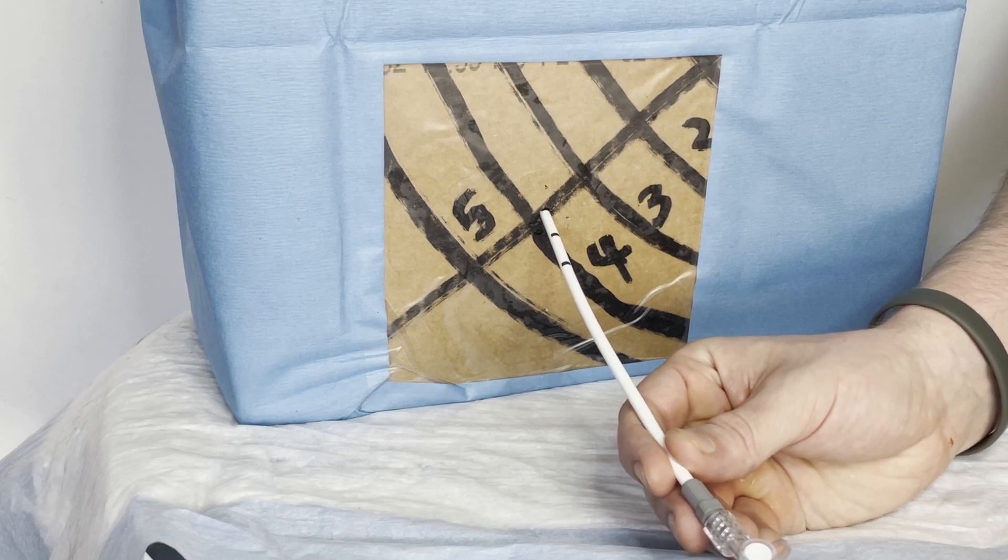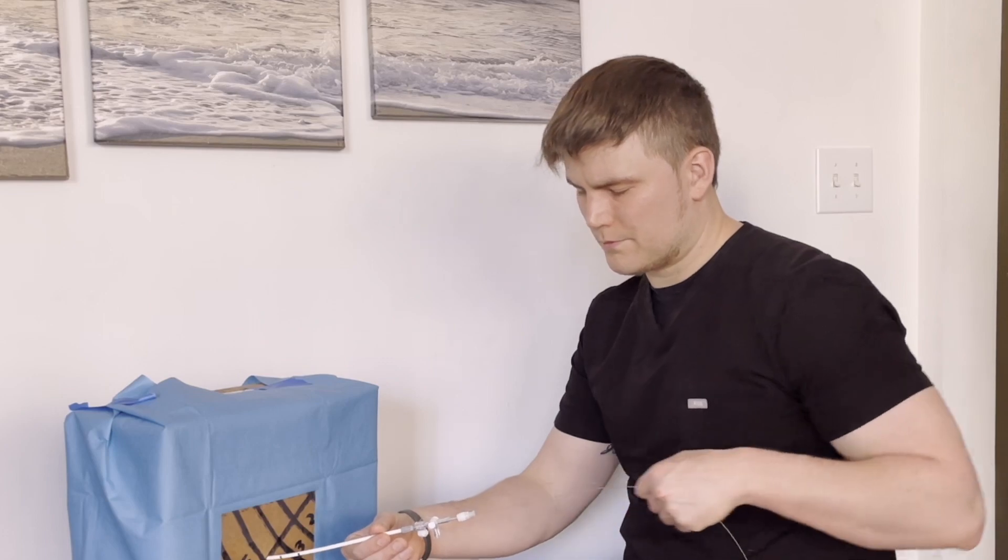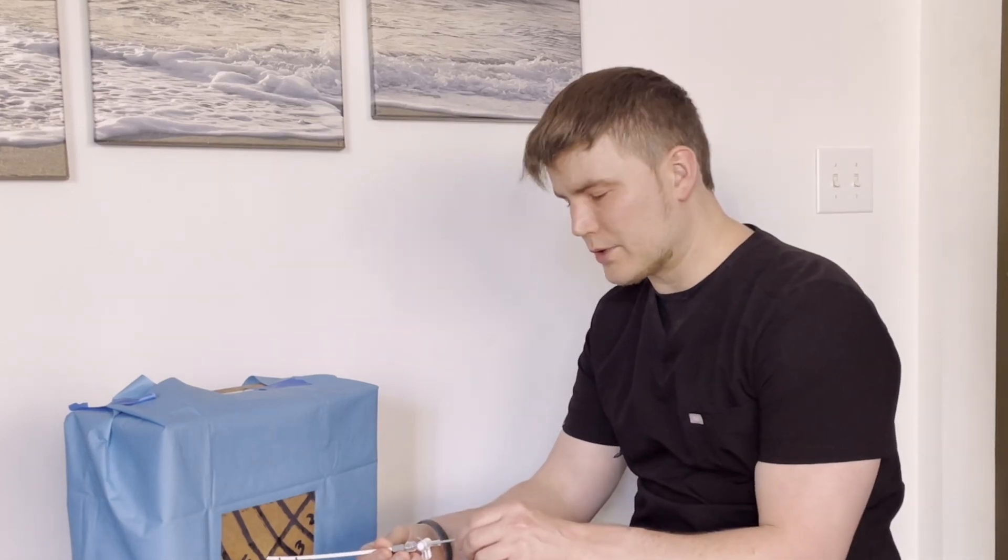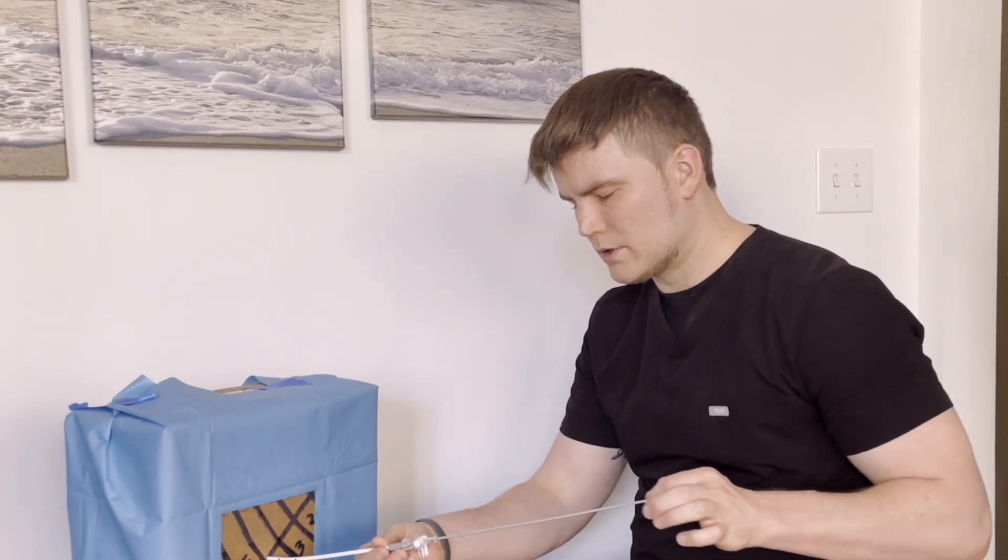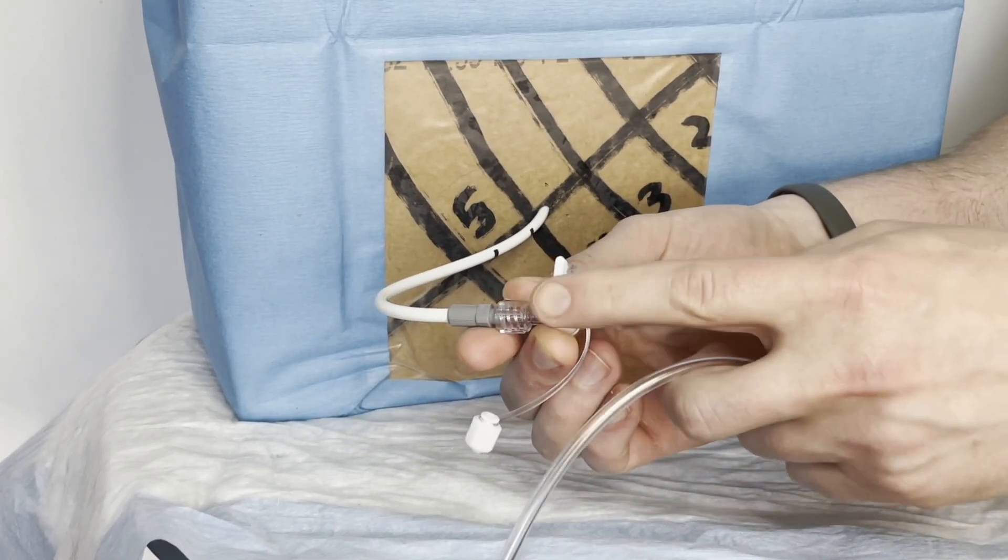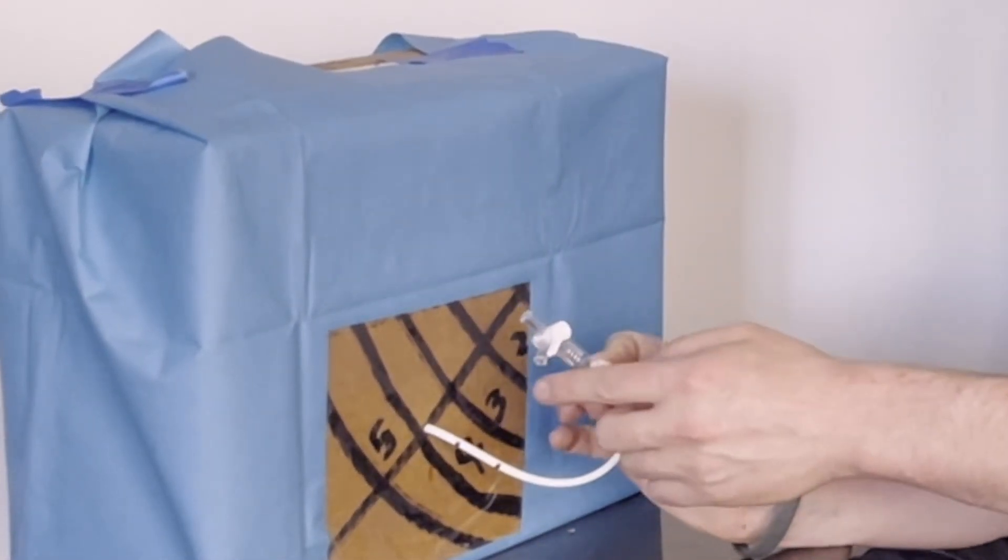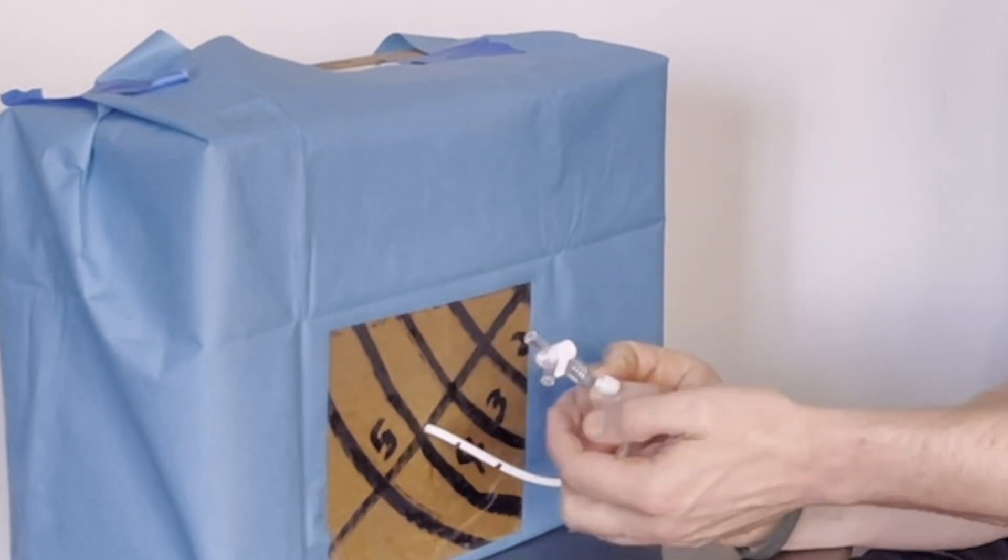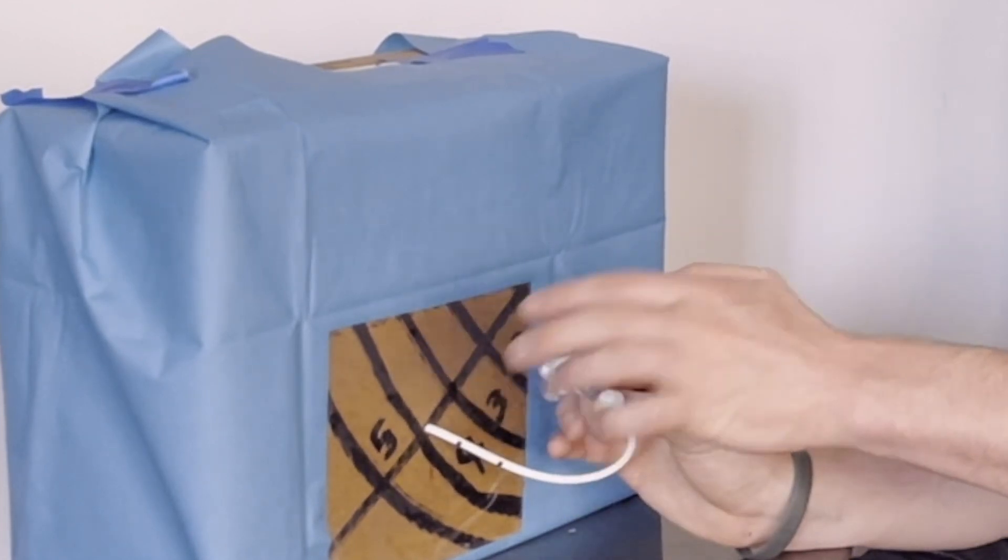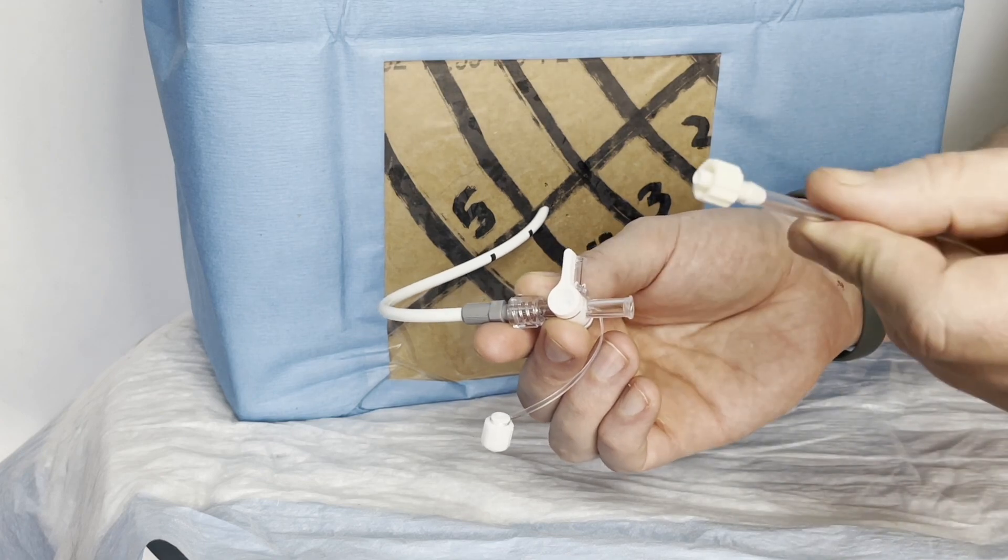And we're going to pull out our guide wire, pull out our obturator. And right now we should be getting air. If you look at this locking mechanism, this is an off button, and the off button is pointing down towards this location. This location is free and open, so that air from the chest cavity is coming straight out of this location here.